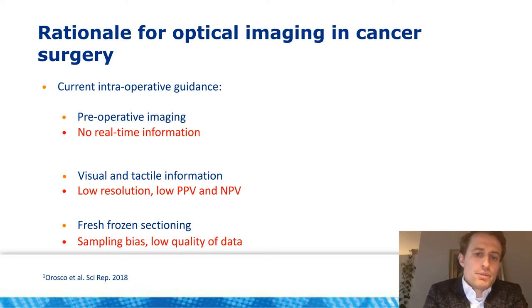Then during surgery, the surgeon uses most of the information he gets from visual and tactile information, and we all know that the human eye has a really low resolution. It comes with a low positive predictive value and low negative predictive value.